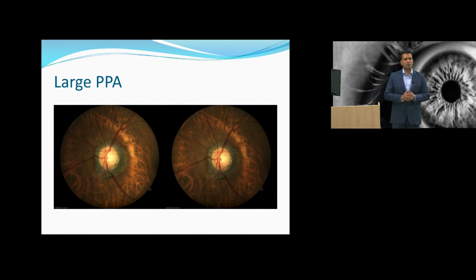And peripapillary atrophy is not a constant. It can vary over time. So make sure you write down where it is present and how large it is. And if you find that it is increasing, that may signify certain changes or progression in glaucoma.